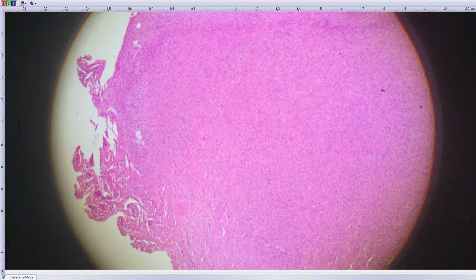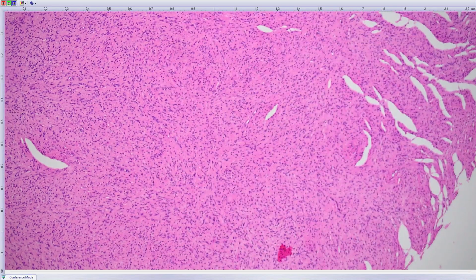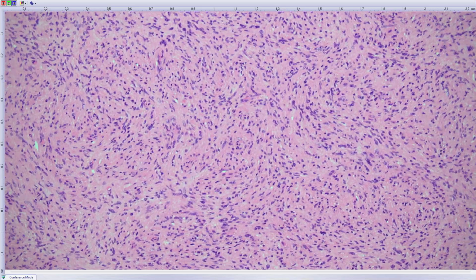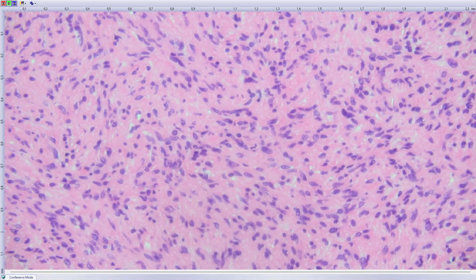So this was a tumor on the finger, 70-year-old lady. It's just from routine biopsies. Basically, you feel this is going to be a mesenchymal tumor, a lot of spindle cells, not much mitotic activity, just mild atypia.